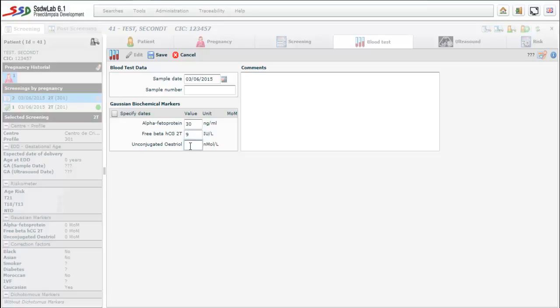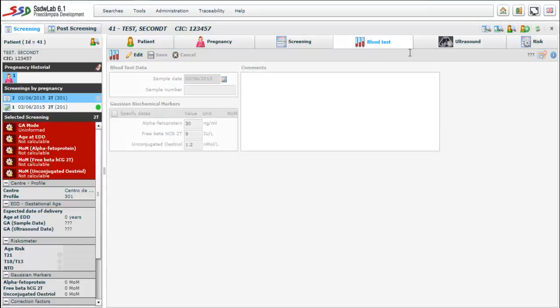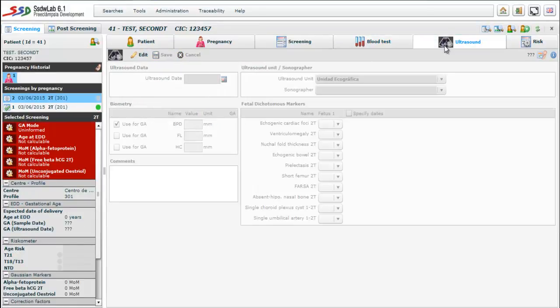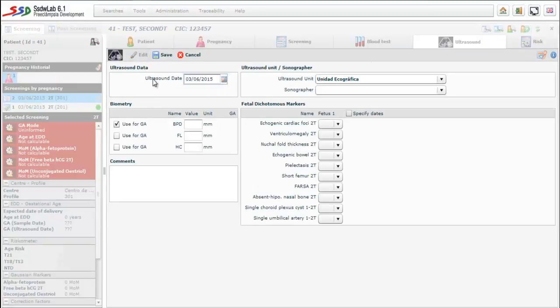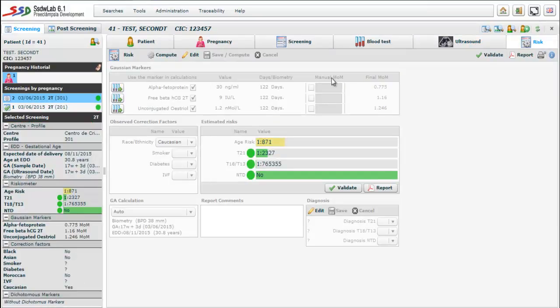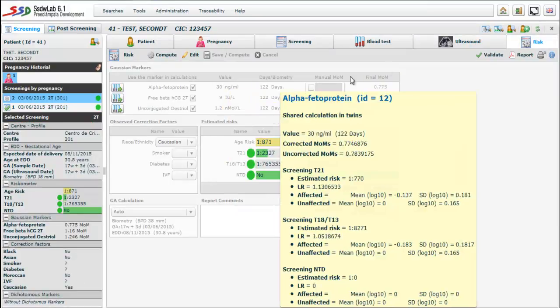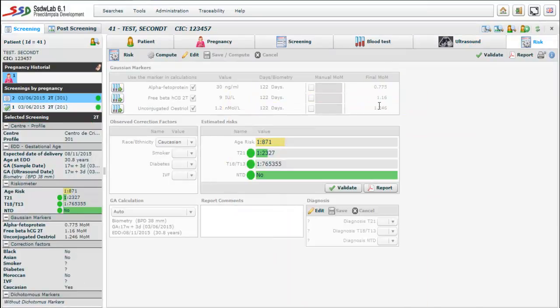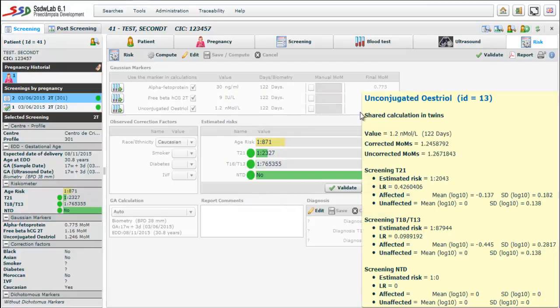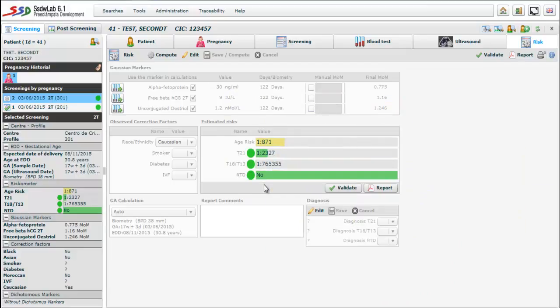Once we introduce the value of all markers, we go to the next folder that as we have seen before is the ultrasound folder. Once we add the value of the BPD, the risks are calculated. We can observe in the risk folder the values of the Gaussian markers, their respective MOMs, and the risk for age, trisomy 21, trisomy 18-13 and neural tube defects.